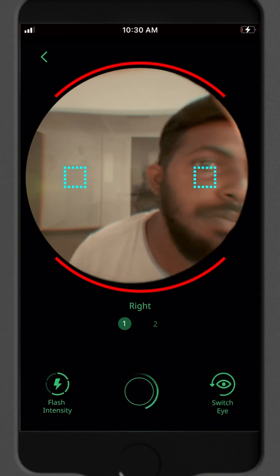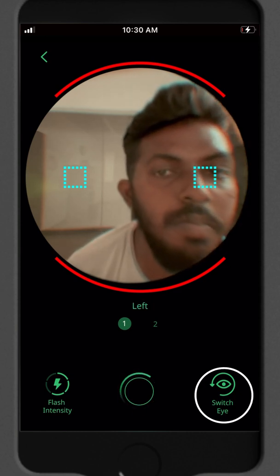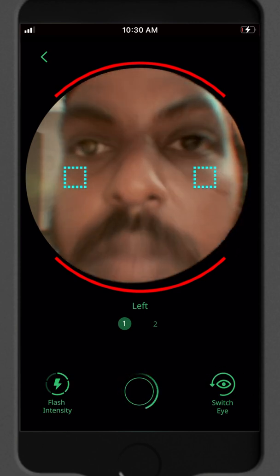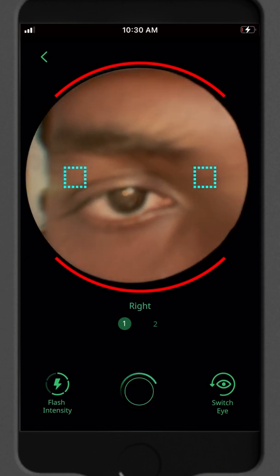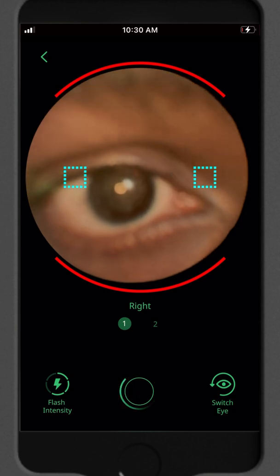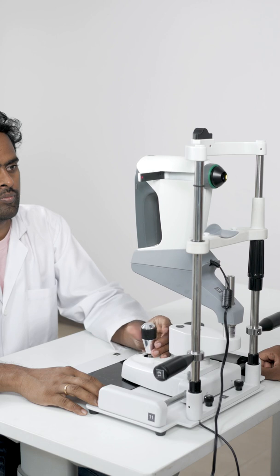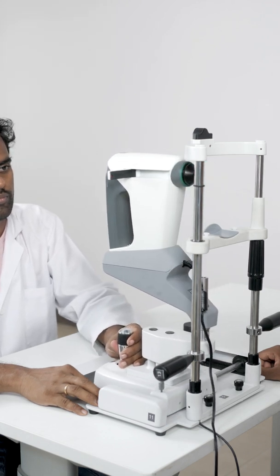As standard practice, the exam always starts with the right eye. If you only want to capture the left eye, tap on this button to switch. You can see that auto capture is already looking for an image. Now you need to bring the retina into view — center the pupil on the screen and slowly move forward until the retina comes to view. Adjust height and move sideways as needed. To adjust the height, rotate the joystick. To move sideways, simply move the joystick around.